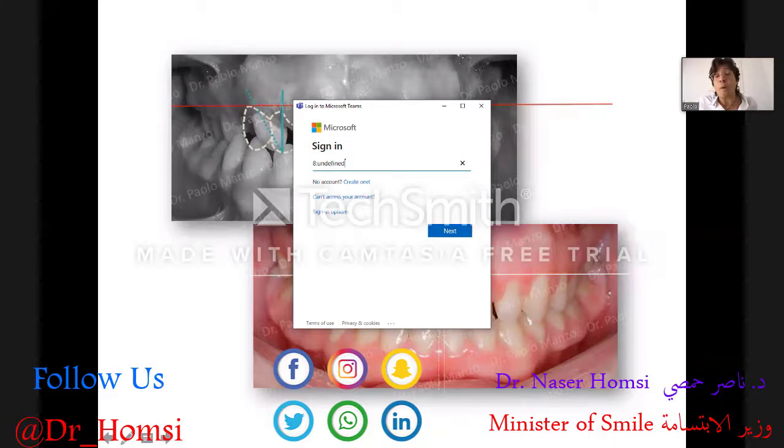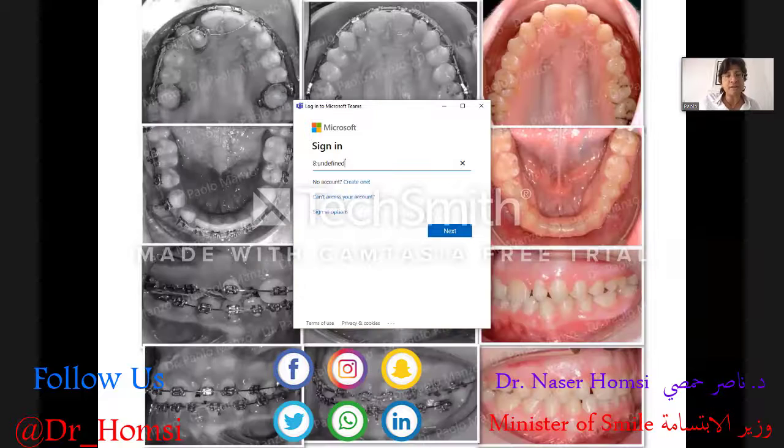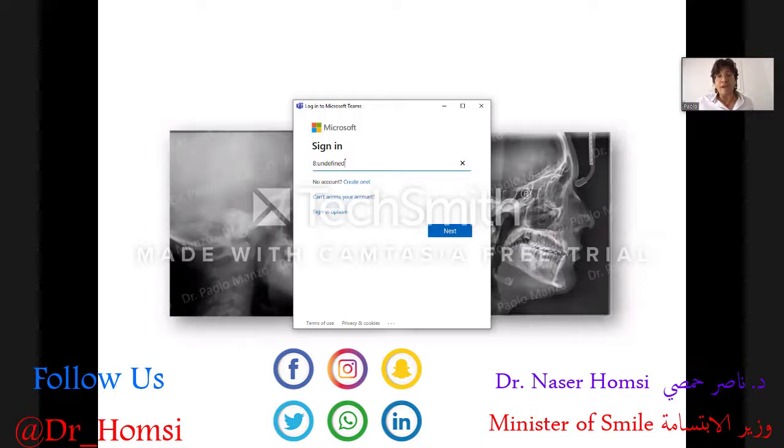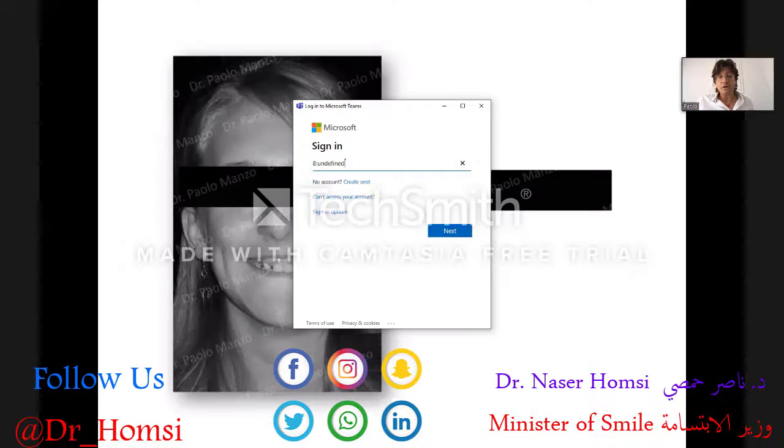We didn't correct completely the dental midline discrepancy, because part of this correction I left to the restorative phase, because one tooth was wider. So the central incisor on the right was wider than the central incisor on the left. And this is the comparison of the beginning of the treatment, the intra-treatment phase, and the end of treatment. At that time, this is the final X-ray, the final panoramic view, okay? And X-ray comparison, lateral cephalometric comparison, okay?